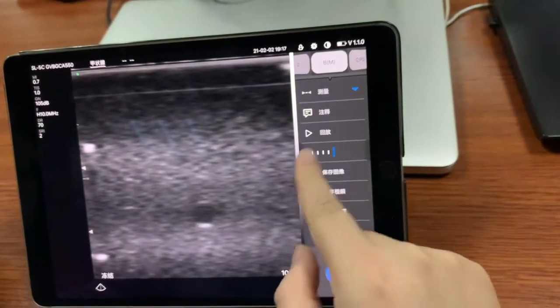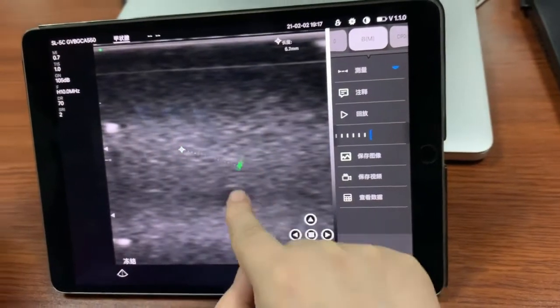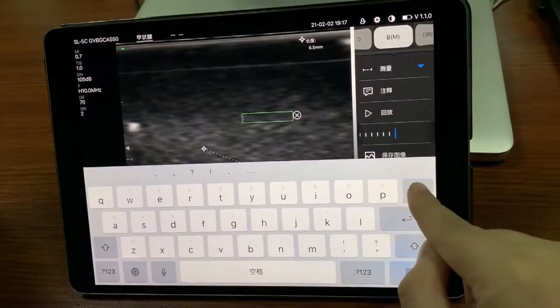When the image is frozen, we can put some measurements here, and also add some notation and annotation.